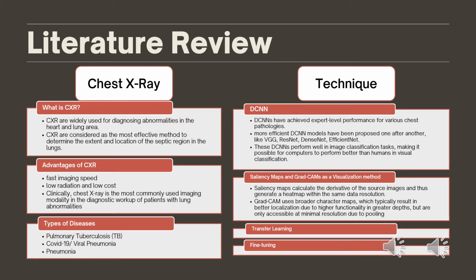Clinically, chest X-ray is the most commonly used imaging modality in the diagnostic workup of patients with lung abnormalities. And the types of disease that chest X-ray can detect are pulmonary tuberculosis (TB), COVID-19 or viral pneumonia, and pneumonia.